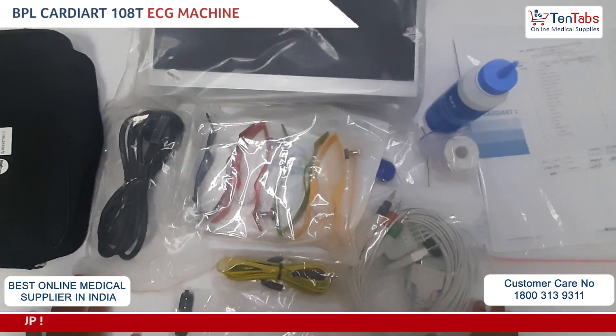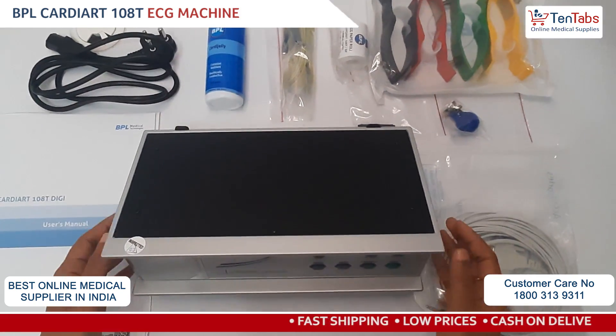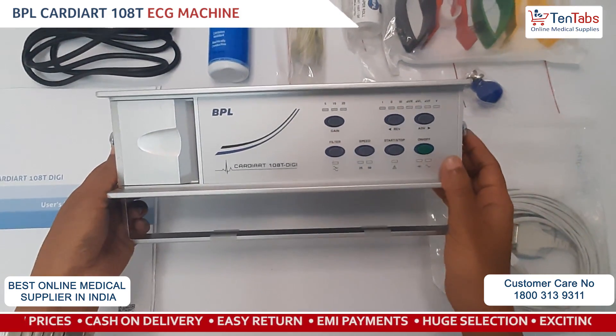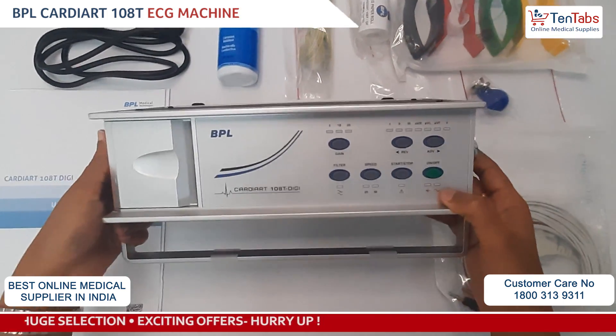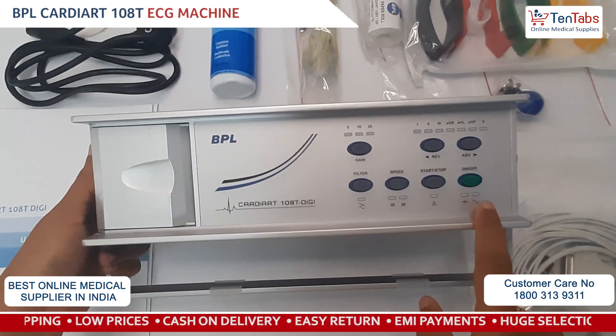This is a single channel ECG machine. Now let's begin with the installation of the BPL 108 Digi single channel ECG machine. Here you see the front panel and the operating keys.